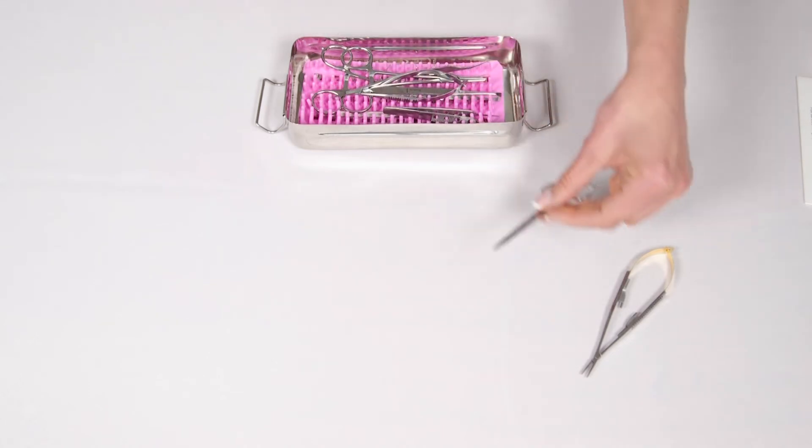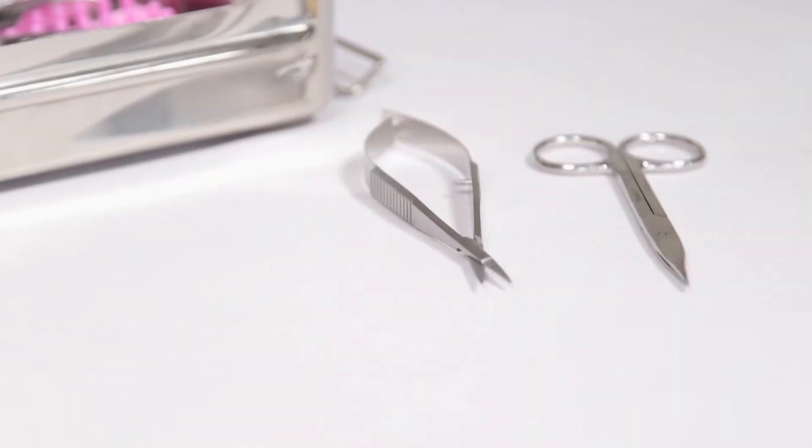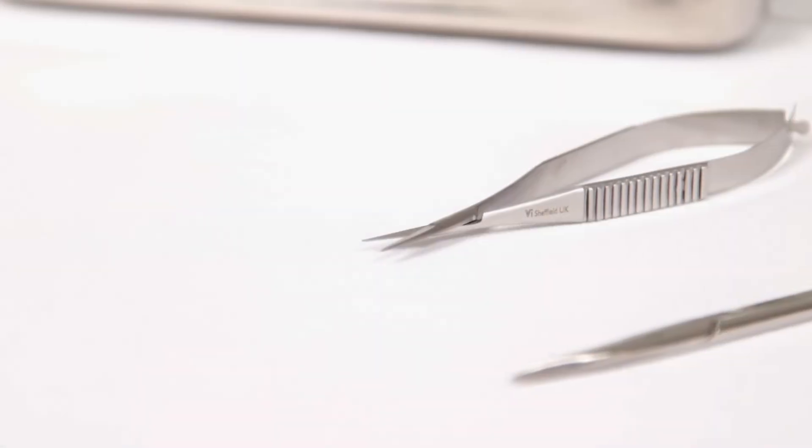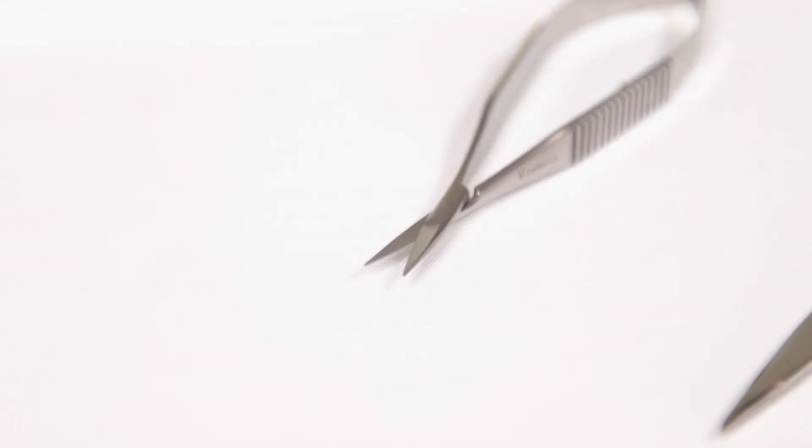There are two different types of scissors included in the kit, a pair of Stevens tenotomy scissors designed for precision cutting and a pair of Castraveo scissors which are a light, delicate and precise scissor commonly used in corneal procedures.